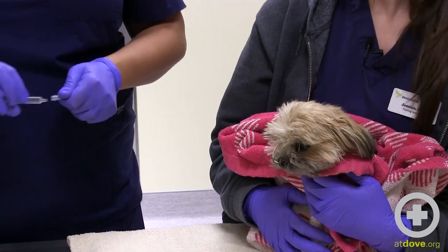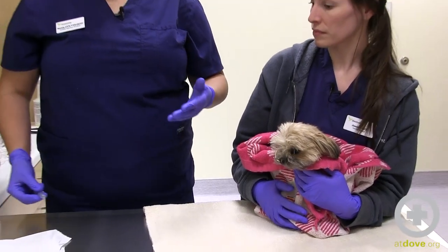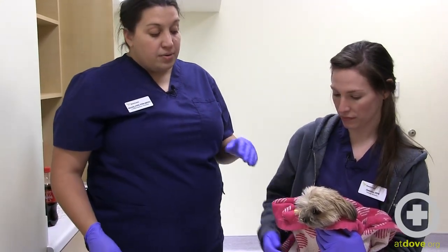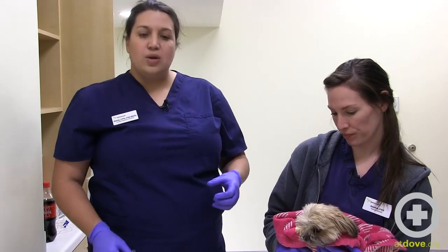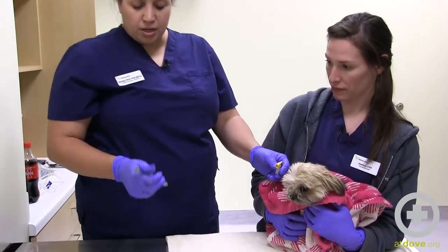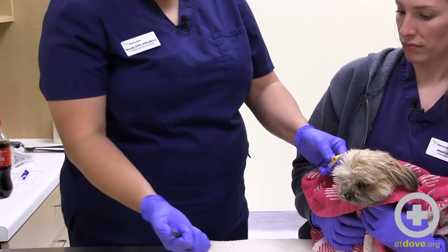One thing I always try first is just to flush with tap water. This is going into our patient's stomach — we placed this tube several days ago and know for sure it's in the stomach, so tap water is okay. I always try to be really conscientious of volumes I give these small patients, because not only is their nose small, but their little stomachs are small too. Putting too much fluid in there could make her nauseous and more likely to regurgitate or vomit.